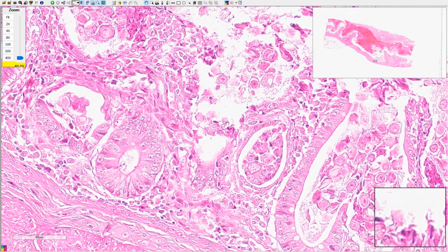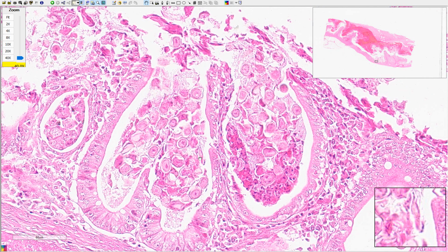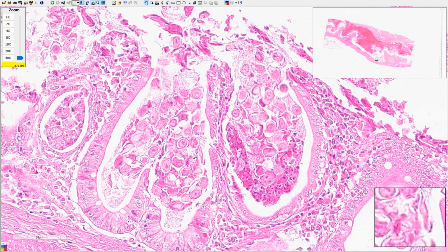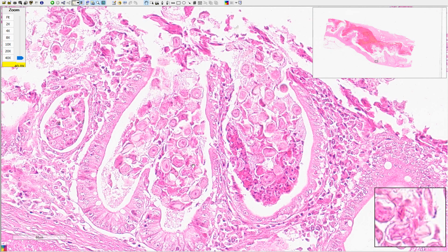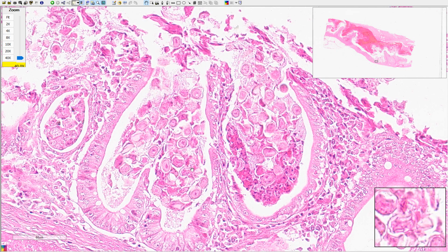Okay, it's easy. For the slides, you can draw the findings, and then you can submit the drawings to teachers for approval. I think that's all for the first slide. I'm going to continue with the second slide about coccidiosis in cattle.